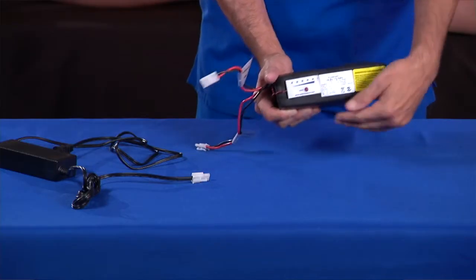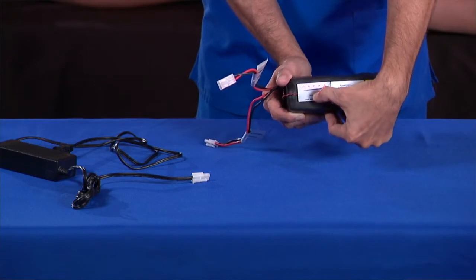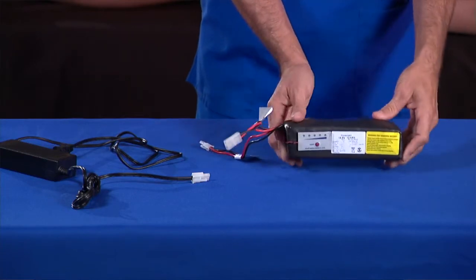To test the battery charge, press and hold the button on the front of the battery. If the battery is fully charged, all the indicators will light up.